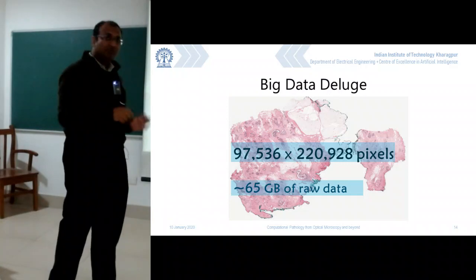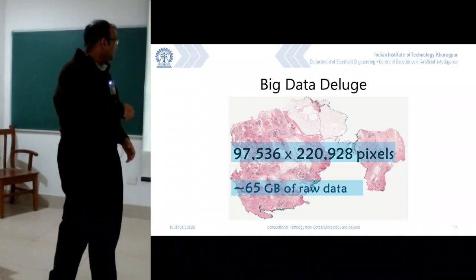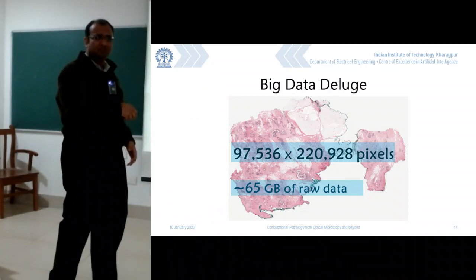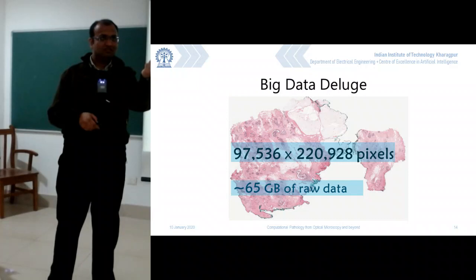Now why do you need that? Because if I make this whole image half of this one, so if this was 98 then that would be 49, some 49,000 cross 110,000 pixels over there. Essentially, from 49,000 cross 110,000 pixels coming down to this particular location, every 1 pixel will have to be mapped into 4 pixels, otherwise that will not happen.